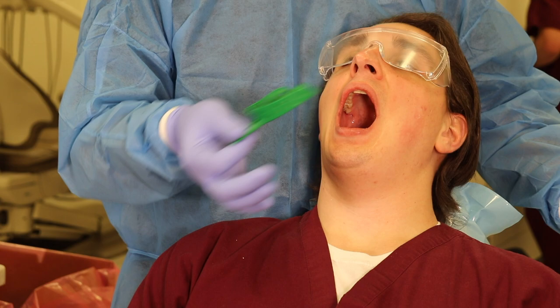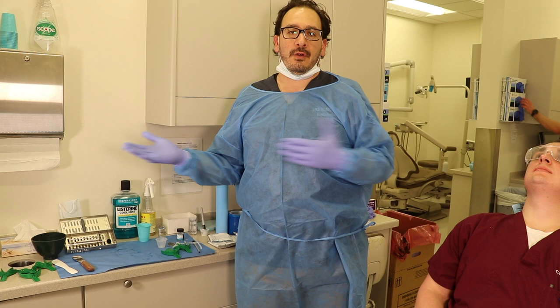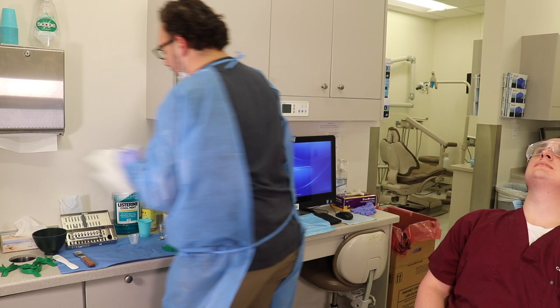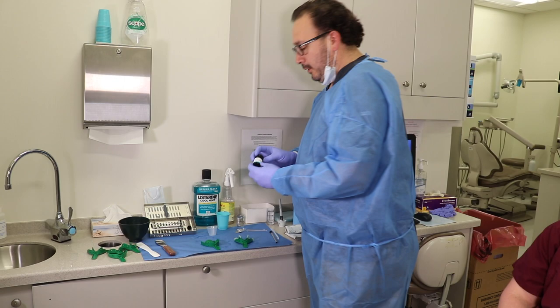Now that we have chosen the impression trays we need, it's best to do it this way so you don't cross contaminate and you get to try small, medium, large. Using the back of the mirror, you can get a ballpark idea. Okay, so let's go for the next step. Now that we've checked the patient's mouth and decided which tray we're using, when we're using plastic trays, we need to put some adhesive on.